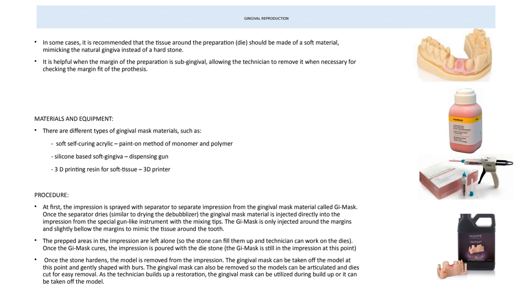As the technician builds up a restoration, the gingival mask can be utilized during build-up, or it can be taken off the model so we can see the accuracy of the margin.